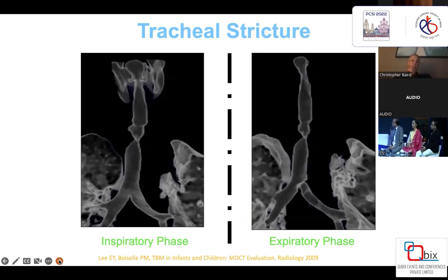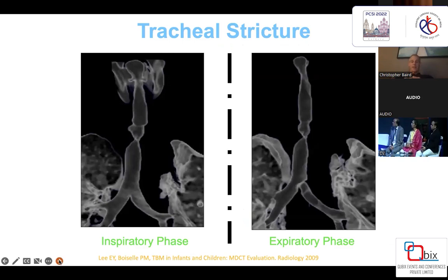This is a CT scan showing tracheal strictures in both the inspiratory and expiratory phases, demonstrating there's really no difference with a dynamic phase when it's a true tracheal stricture.